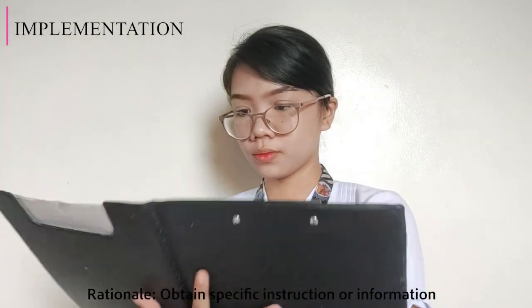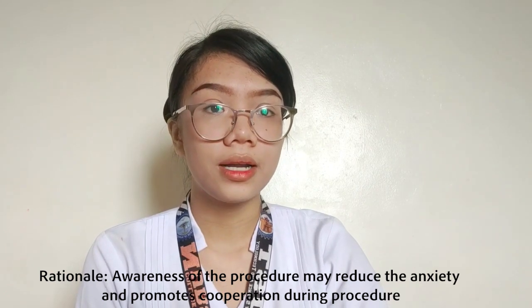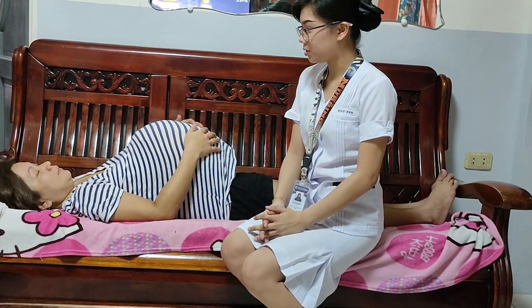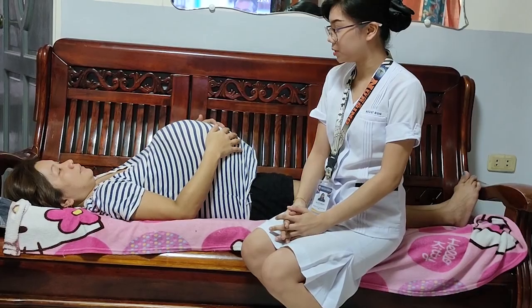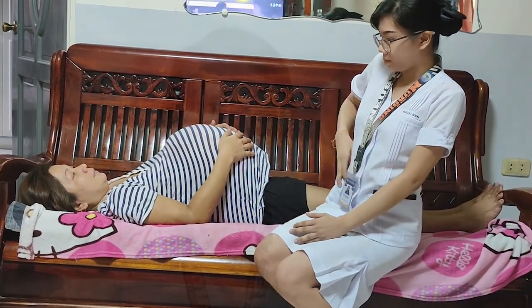For the implementation, check the physician's order to verify the procedure. Before performing the procedure, introduce yourself and verify the client's identity using agency protocol, then explain to the client what you are going to do and why it is necessary, and how they can participate. I'm Angela Tolentino, student nurse from NAUSD, and I will be performing Leopold's maneuver, obtaining your fundic height and the fetal heart rate. Next is to provide the client's privacy.